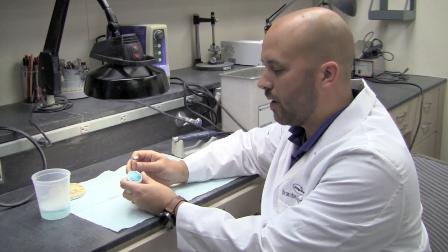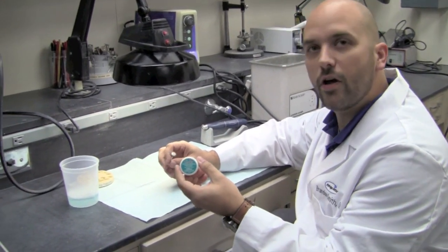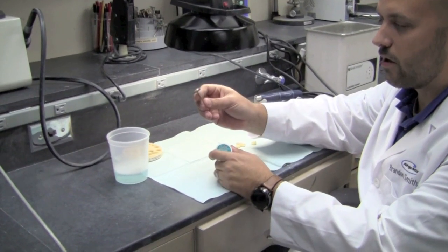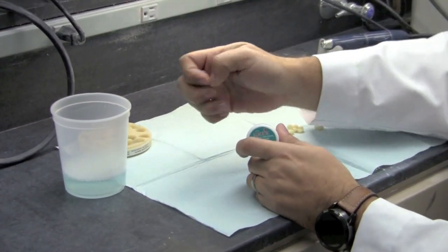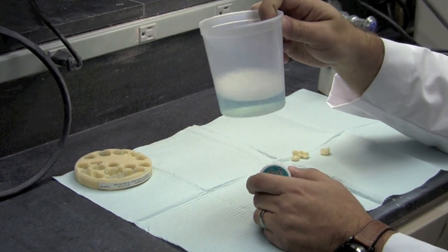All you're going to need to polish the PMMA is whatever zirconia polish you have on hand, just a soft goat's hair brush, and then you'll also need a little container with some Dawn dish soap and water in it.